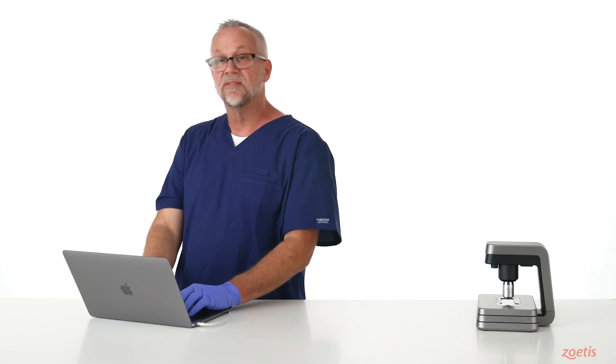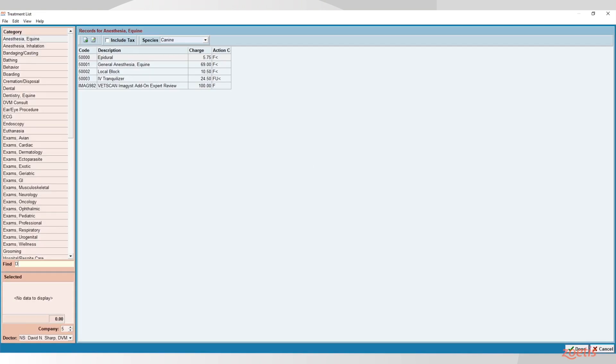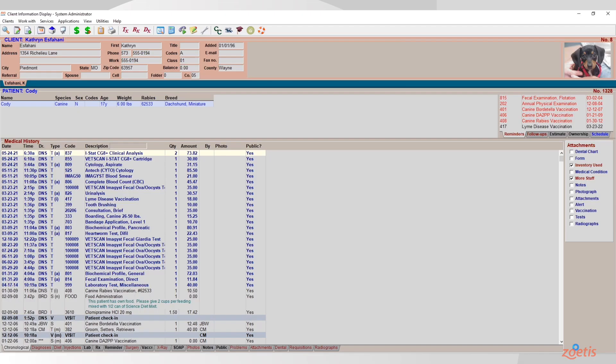Next, we're going to move over to our practice information management software and locate the animal's chart and medical record for who we are going to run the test. In this case, we're going to enter the treatment code for cytology for a test for Cody, a dog with a patient ID of 1328.